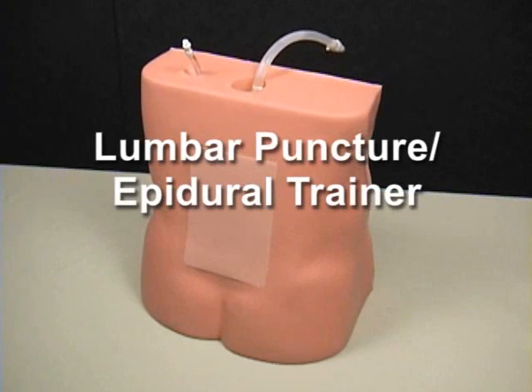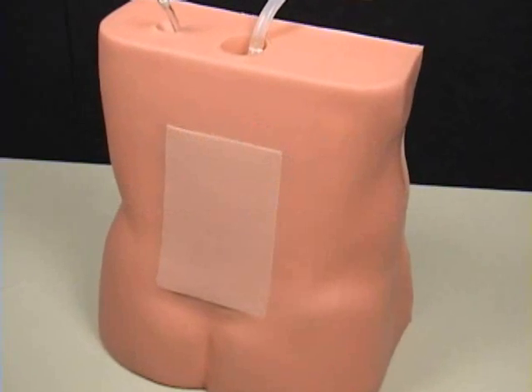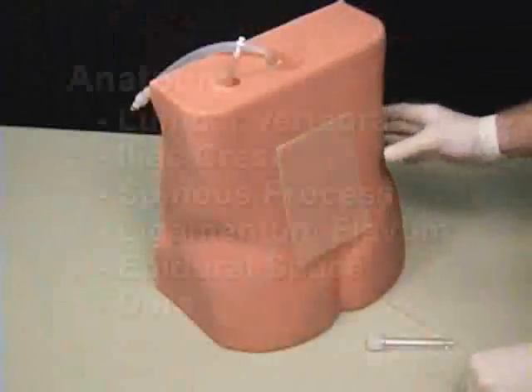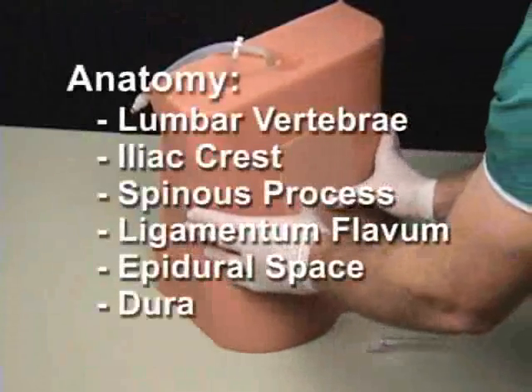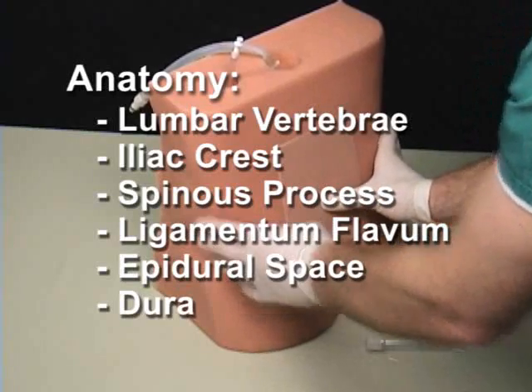The Lumbar Puncture Epidural Trainer is an ultrasound-compatible model that is anatomically correct. It includes lumbar vertebrae, iliac crest, spinous process, ligamentum flavum, epidural space, and dura.